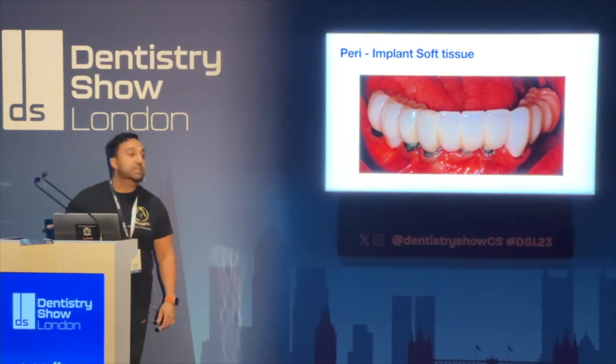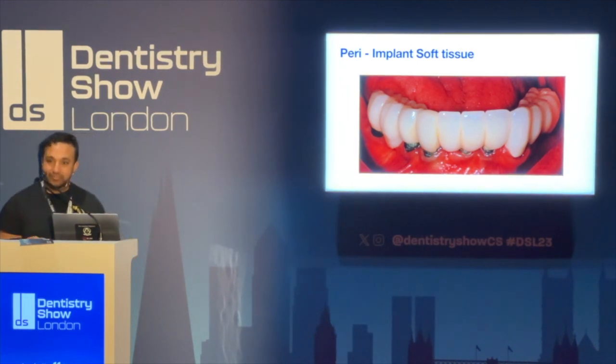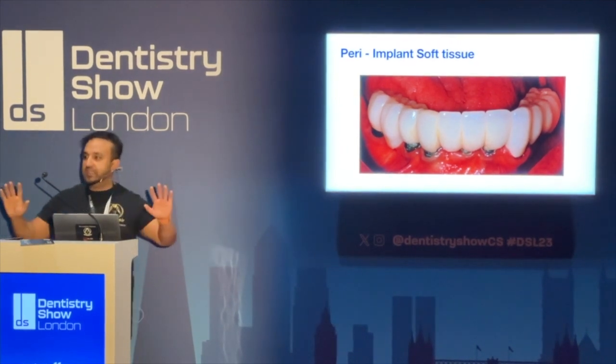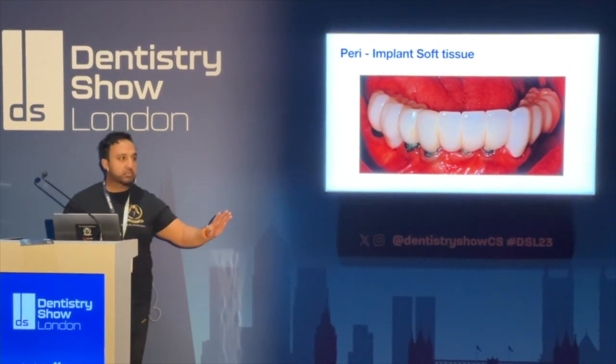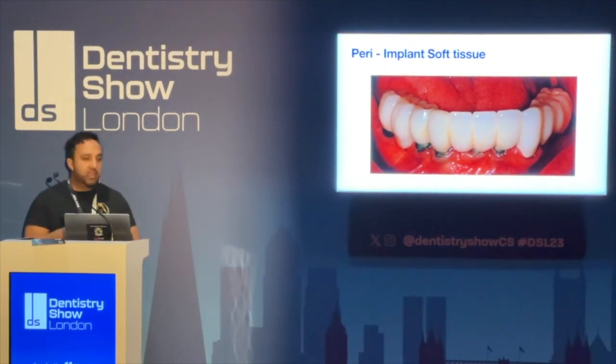So you might be wondering how to deal with this, because this prosthesis will be actually solid, right? And what you don't want to do is tell the patient, oh well, all your implants have failed, that's it, you're going back to the implant surgeon and he's going to redo it all. You don't want to do that. That's doing a disservice.